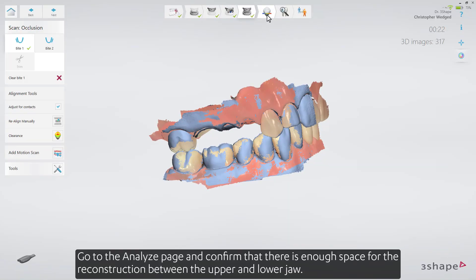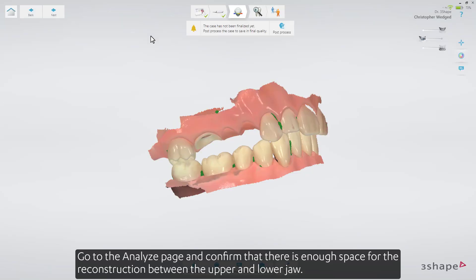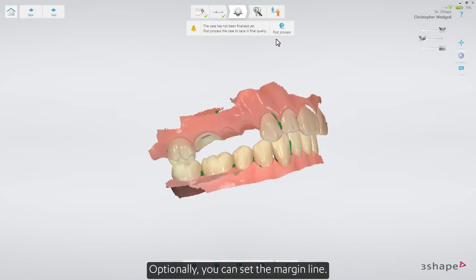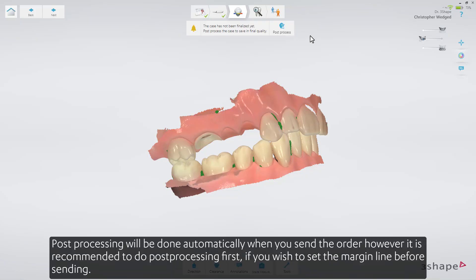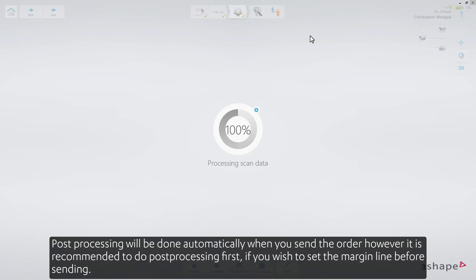Go to the Analyze page and confirm that there is enough space for the reconstruction between the upper and lower jaw. Optionally, you can set the margin line. Post-processing will be done automatically when you send the order. However, it is recommended to do post-processing first, if you wish to set the margin line before sending.